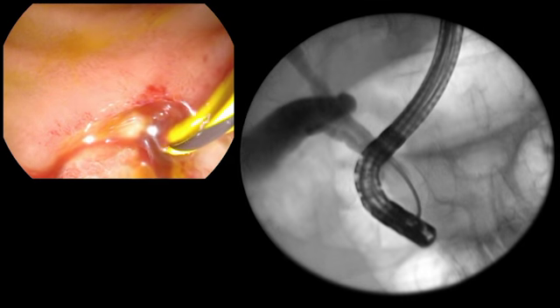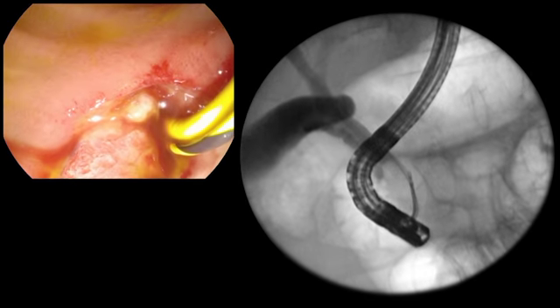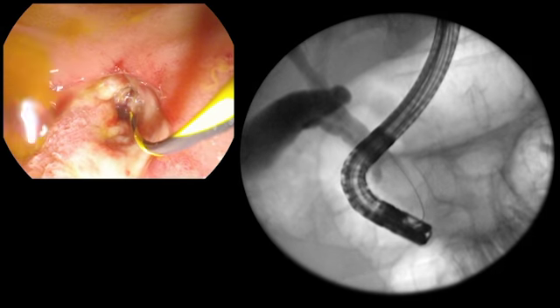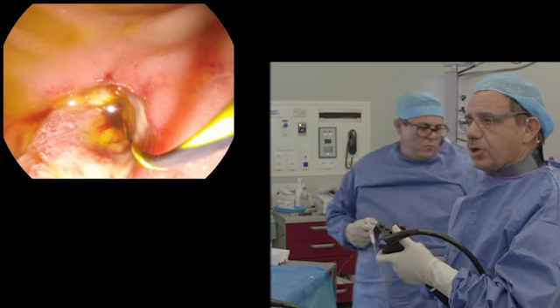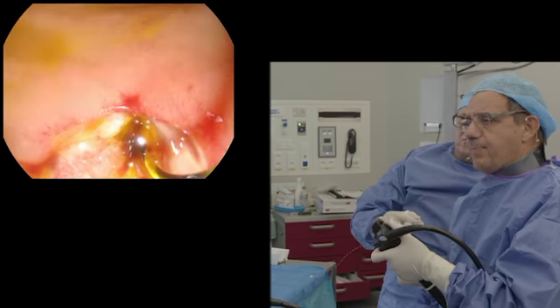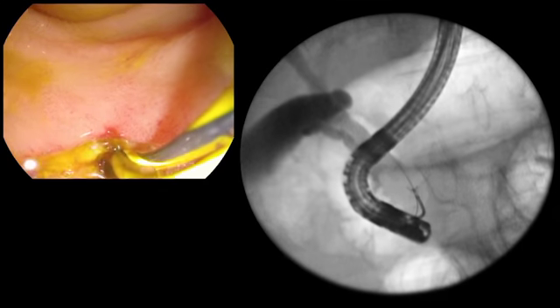Open the forceps. Okay, now the forceps is open, and I pull back the forceps just underneath all the stenosis here. Now I push against the stenosis, close. Okay, and now we have one biopsy. Here you see now very well the tumoral infiltration of the lower part of the bile duct. And I'm convinced that this case is more often a cholangiocarcinoma of the lower part of the bile duct than a real ampullary lesion. Okay, again. Open. Close.